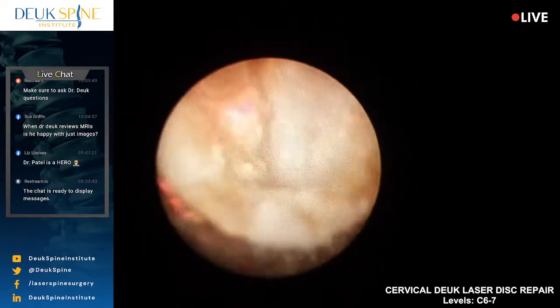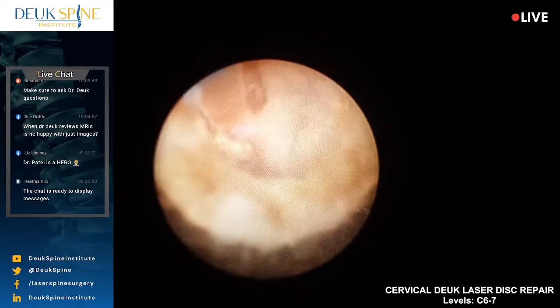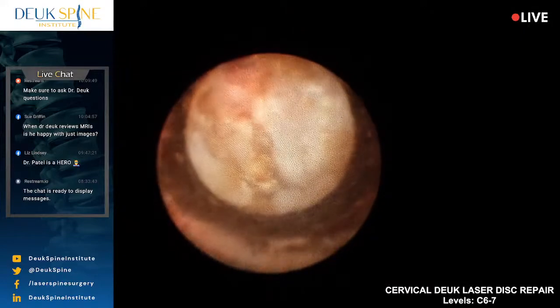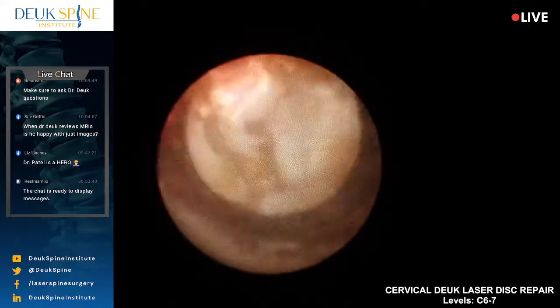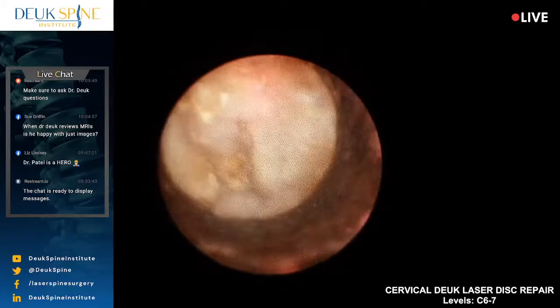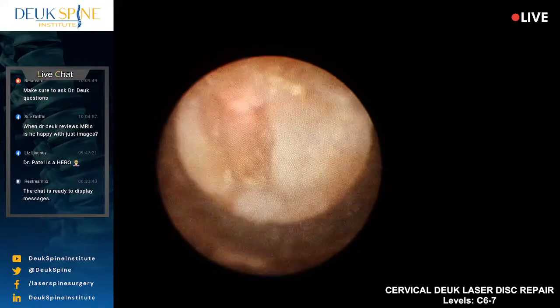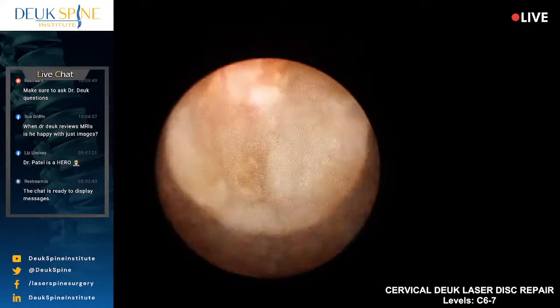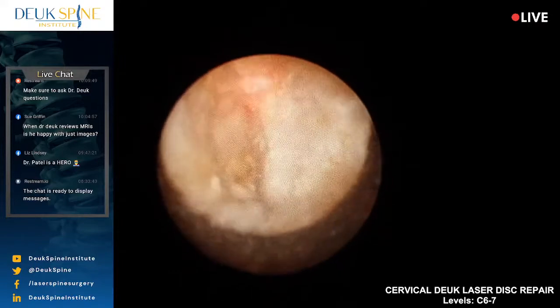This is actually pushing on the nerve and spinal cord. So I have to remove it using the laser. Again, you're gonna... oh, there's a herniation right there. You guys see that herniation just slip out? That is sitting on the nerve root. Now it's out into the disc space. We call that a reverse herniation. I coined the term, the first time ever used, called the reverse herniation.